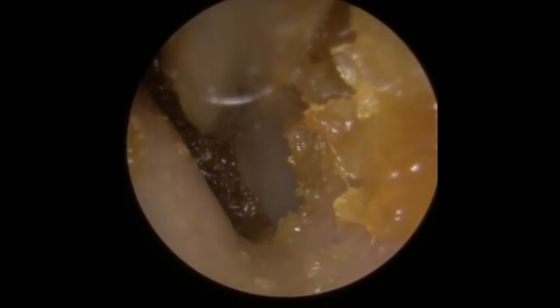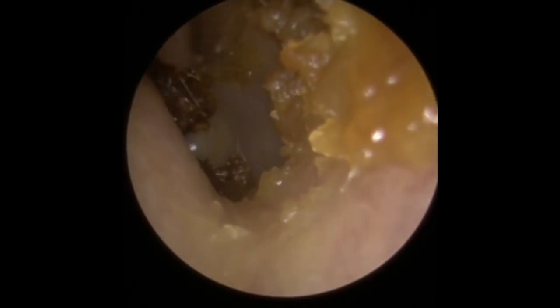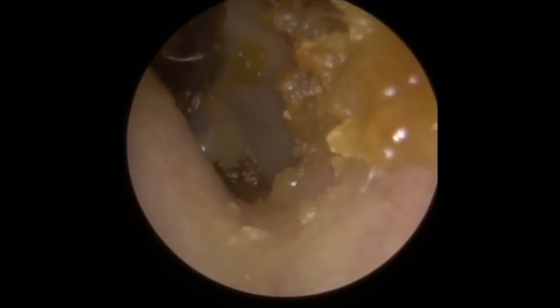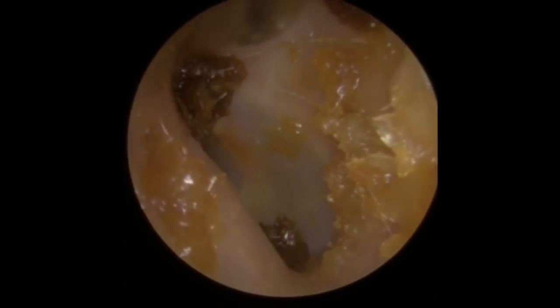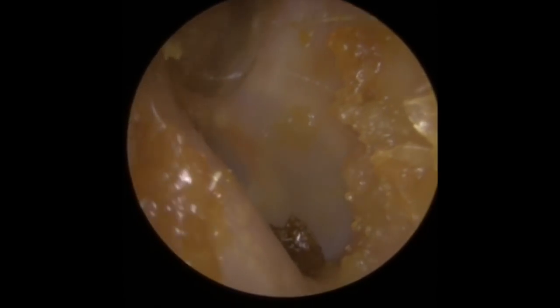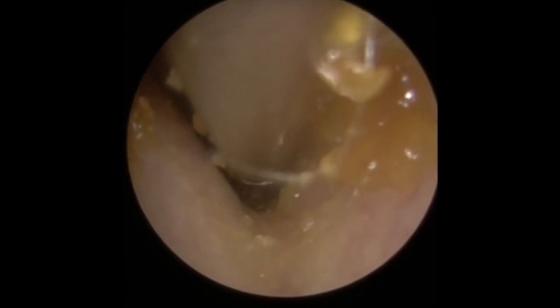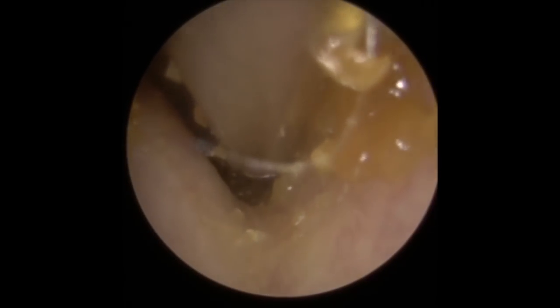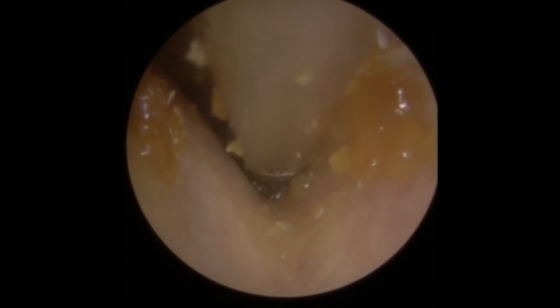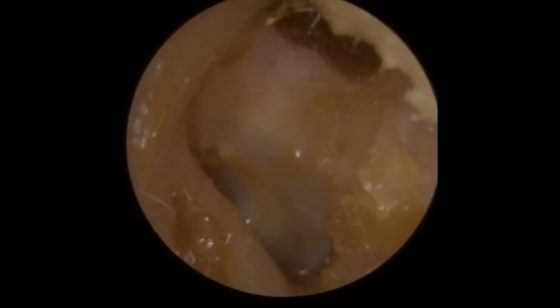We're trying to strip away the right side first. I'm going to try and get a grip on this piece — try not to touch the canal wall too much. You can see it's just all getting sucked in and coming away in nice big chunks. Clearing all the way around and taking this piece away at the top. You really don't want to leave wax in that top portion of the canal above the hammer bone — it's called the attic region. It can become quite problematic if wax is left there. And there we are — the wax is away.